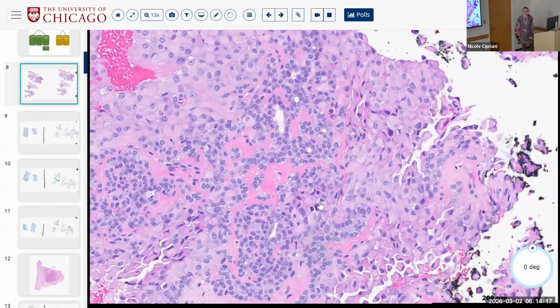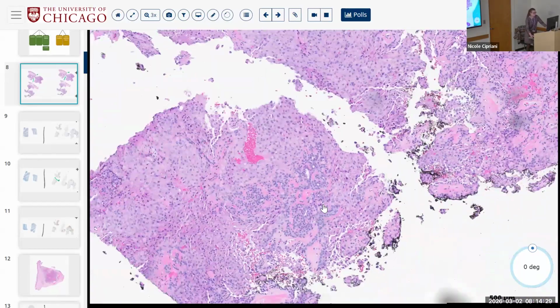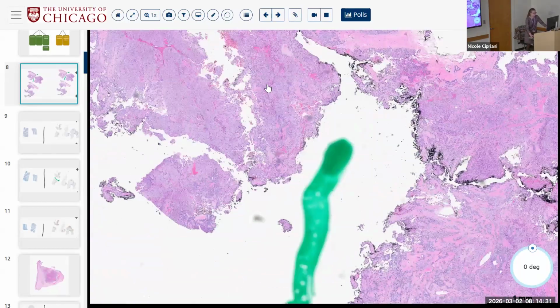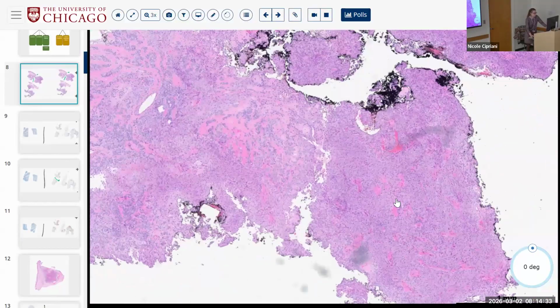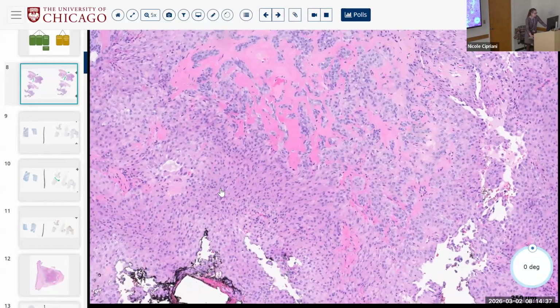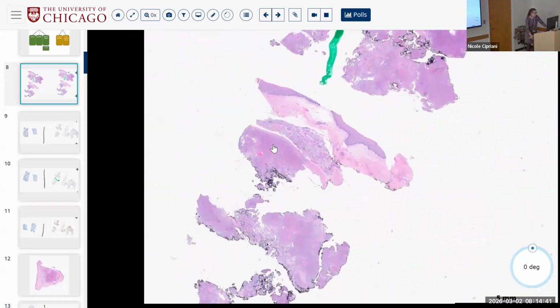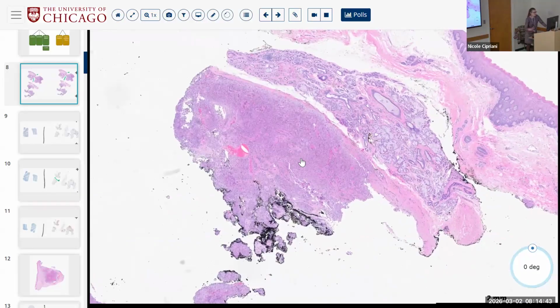Yeah, so I don't know. I kind of wonder if this is some variant. Is this some kind of myoepithelial thing? It's hard to tell if it's monophasic or biphasic. Most of these cells are rhabdoid looking, but then a few of them have less cytoplasm. Yep. So yeah, I guess that's kind of where I'm at morphologically. I don't know if you want a differential right now, or if we're just gonna go to stains. Or, yeah, we can move to stains, since we're gonna throw the same stains on all of it.